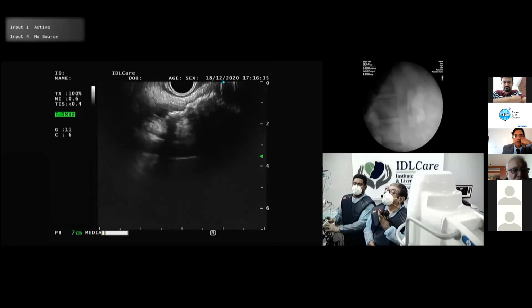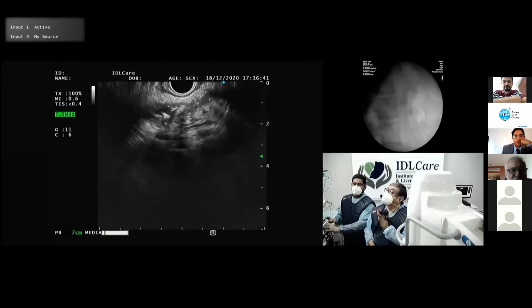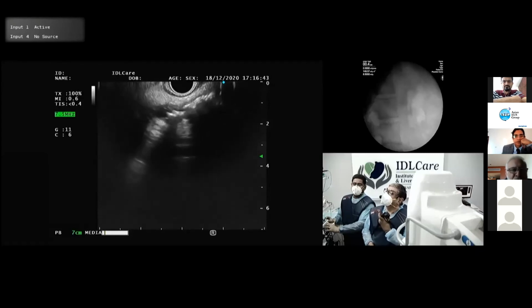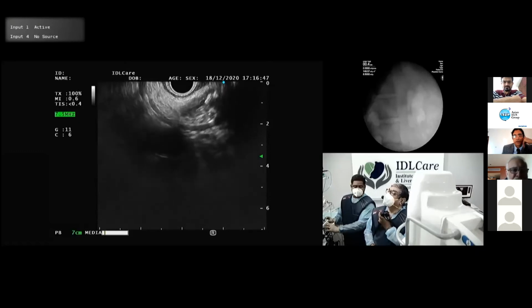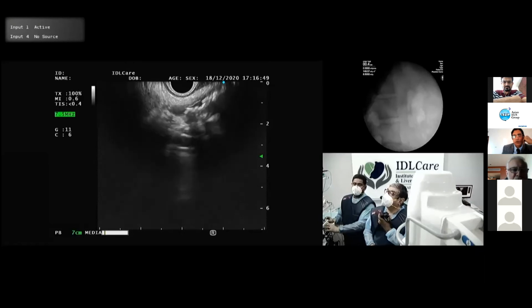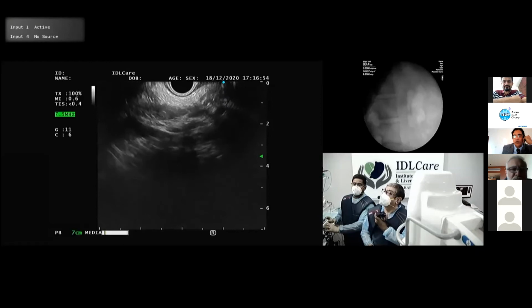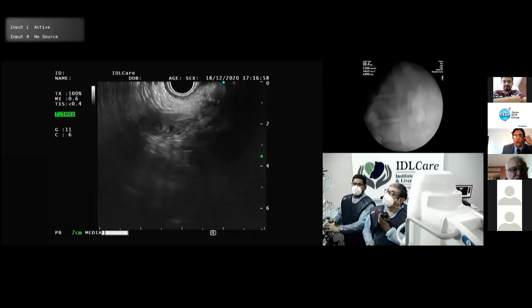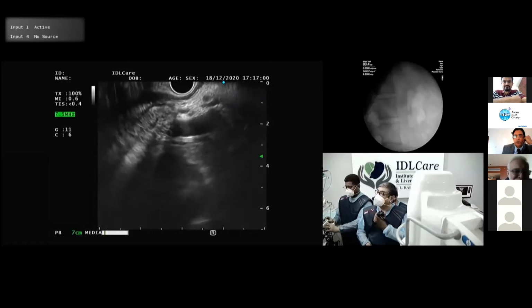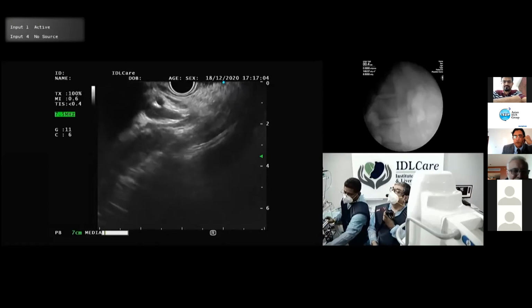See, there is a bunch of stones. Will it benefit her? The pain will go away. Of course, the pain will go, definitely. But it's no long-term solution. We need to plan for surgery in the future? You won't be able to remove these stones, isn't it, sir? We can pass a spy scope through after we dilate to 10 mm.